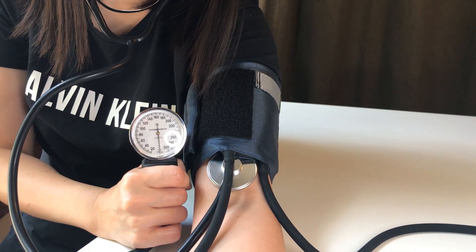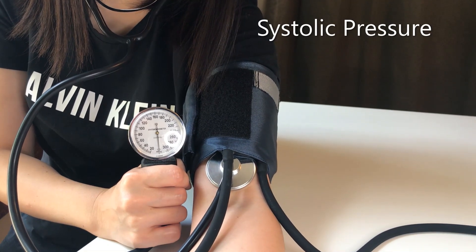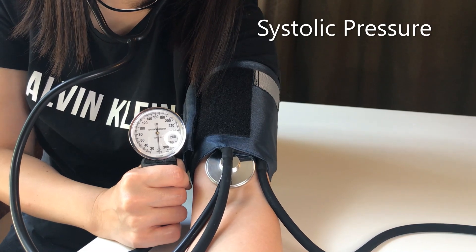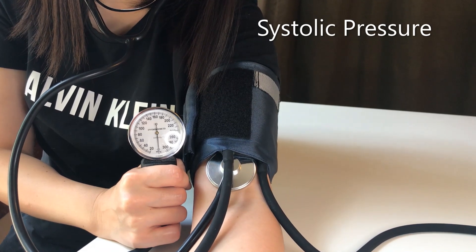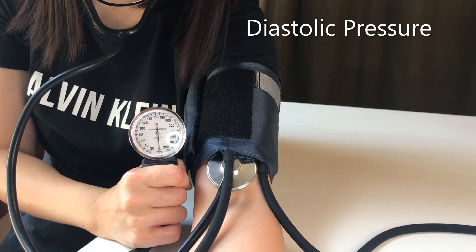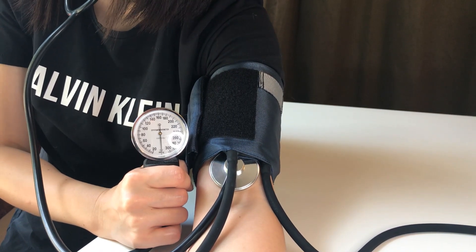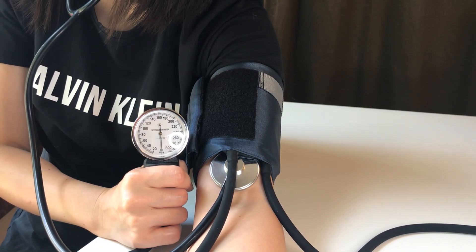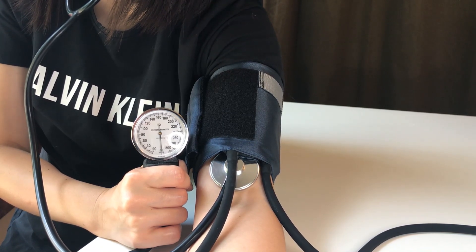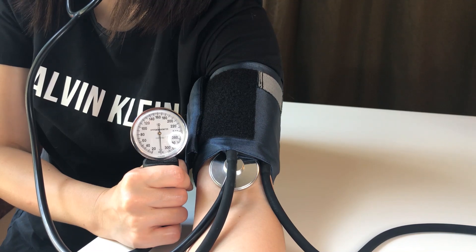You heard the thumping noise, and that was at about 112 — so that's her systolic pressure, a guesstimate of about 112. Systolic pressure is the pressure in the arteries during systole of the ventricles of the heart, when the heart is contracting and pumping blood out. I was able to visually estimate that by noticing the needle starting to hop — that's when the blood is squeezing through, and that's when she heard the thumping noise.